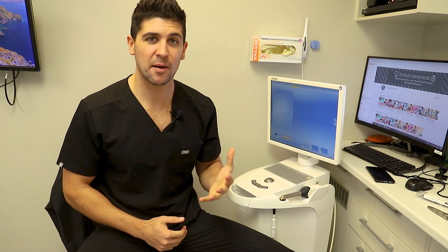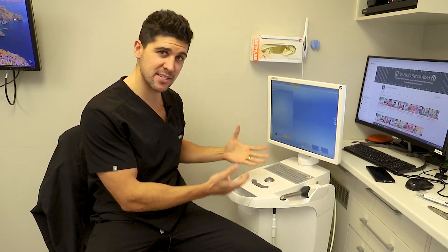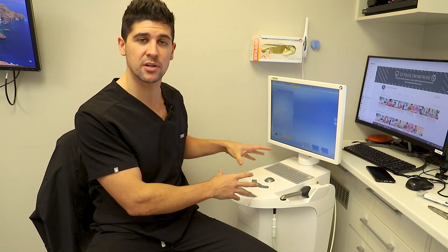Hey guys, Dr. Paul here. I'm lucky enough to work at a practice that has a CEREC machine. We use this every single day. Basically it means that we can do crowns in the same visit. How we actually do it is you scan the tooth, it makes a 3D image, and then we've got a machine that actually makes the crown.